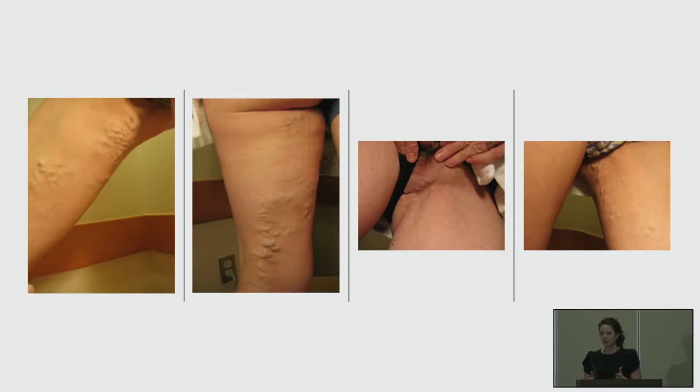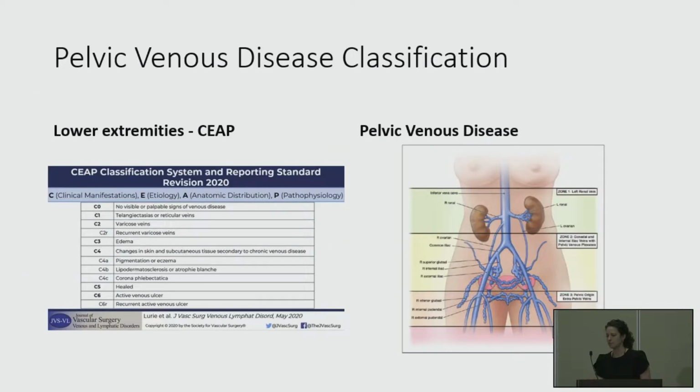And when you're looking at them, any veins that are coming from the top part of the anterior thigh, you can kind of do an I/O leak point. Again, as you're seeing that, the far right images would be more towards the perineum. So again, these are very common presentations of pelvic source varicosities that we're going to see.